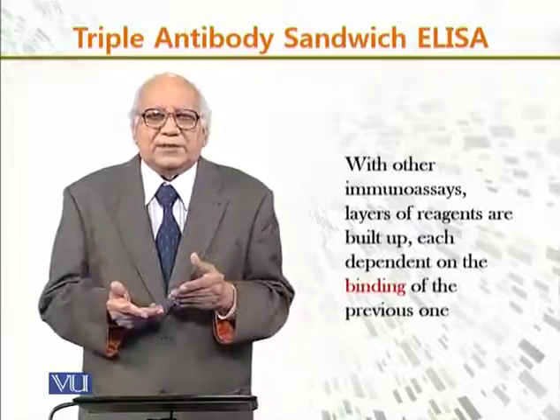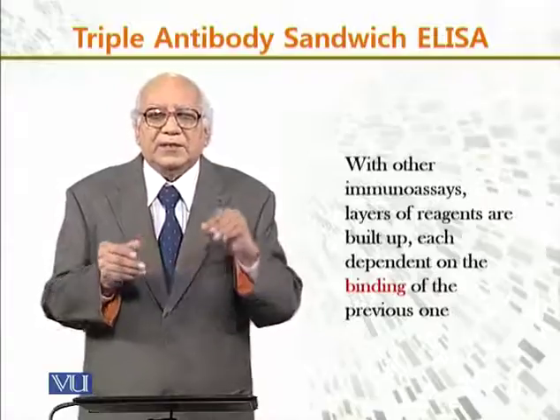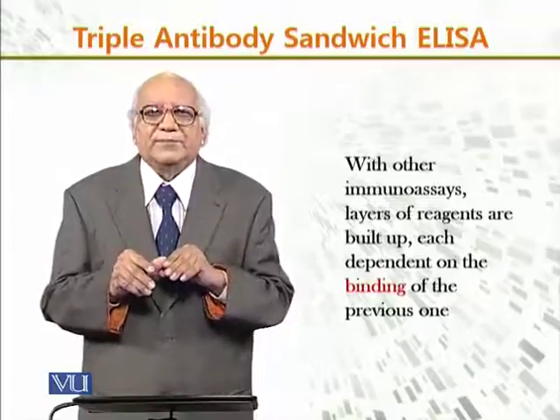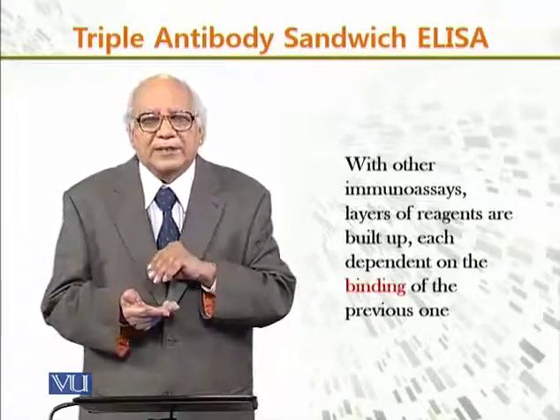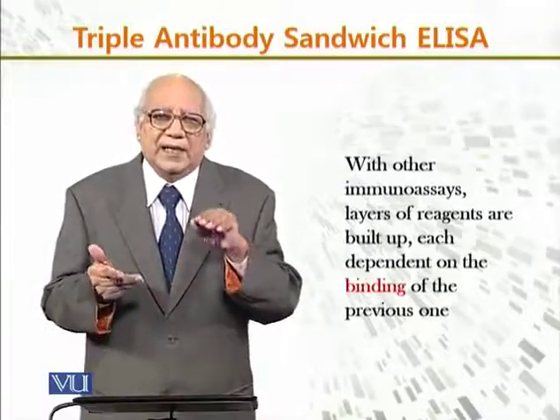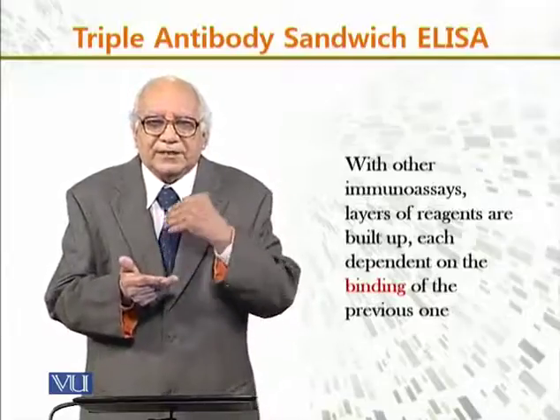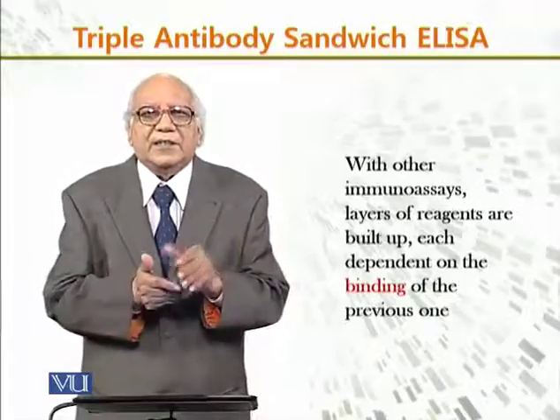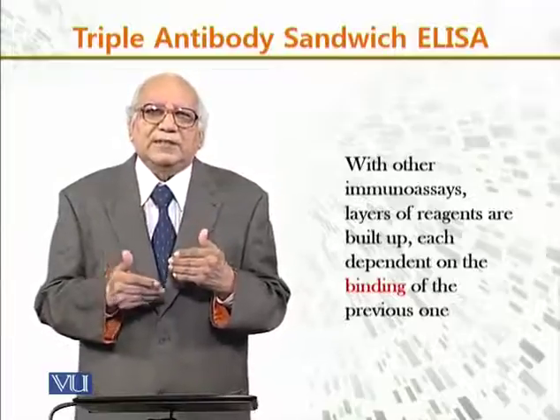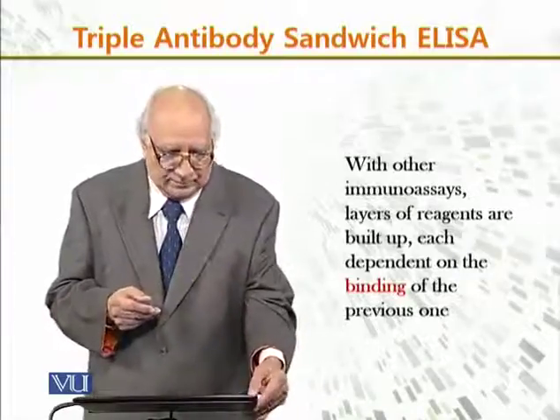Now the layers of reagents are built up, each dependent on the binding of the previous one. When these layers are built up, they depend on whether the previous reagent is attached or not, just like photographic plates, when we develop them and use different reagents to check.